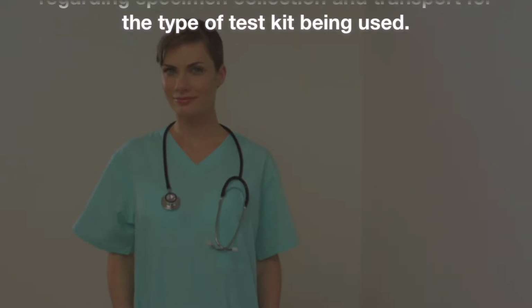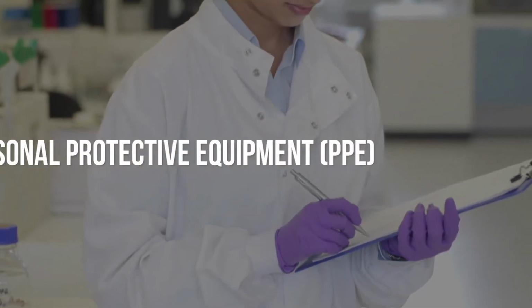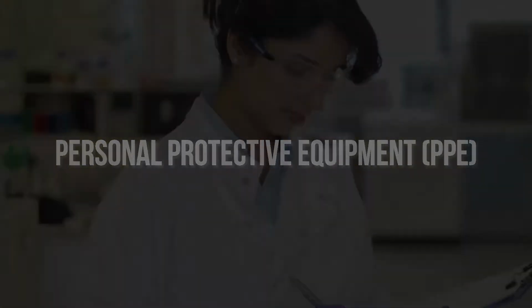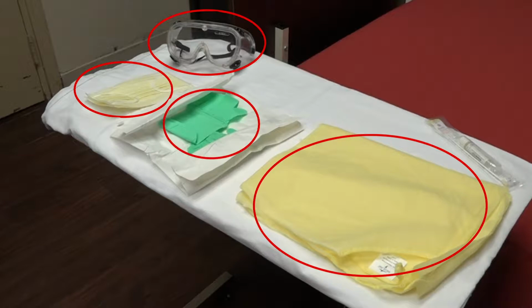In addition to collecting the specimen correctly, it is imperative that personal protective equipment, PPE, must be worn at all times when collecting a respiratory specimen. PPE includes lab coat, mask (surgical, medical, dental procedure, isolation or laser mask), eye protection, and gloves. This equipment must be worn at all times during a respiratory specimen collection.